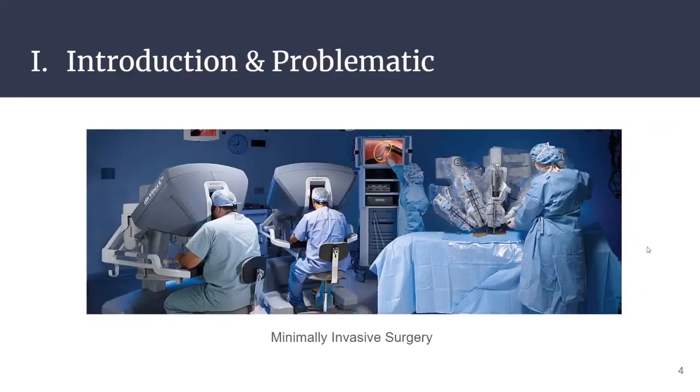One of the techniques used during computer-assisted surgery is minimally invasive surgery. This surgery is performed using long sticks that are inserted directly into the patient's abdomen.